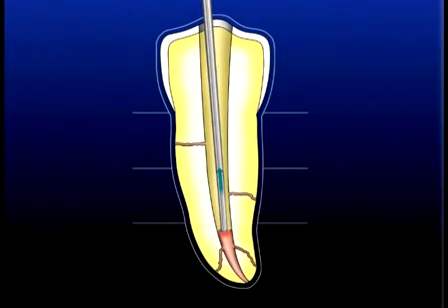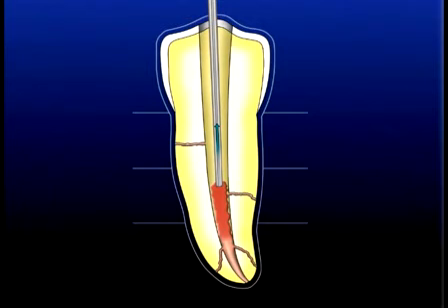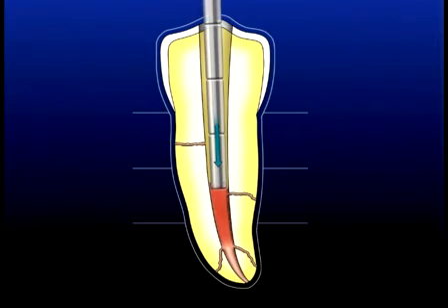The backpack technique, most efficient, involves using the gutta-percha gun in conjunction with the previously pre-fit Schilder pluggers. The needle is hot, and simply placing this needle against the previously corked apical 1/3 will rethermosoften this aspect of the gutta-percha and allow for cohesion between the aliquot of gutta-percha to be injected and the previously established core. The cycle concludes with a sustained press with the plugger for 5 seconds.